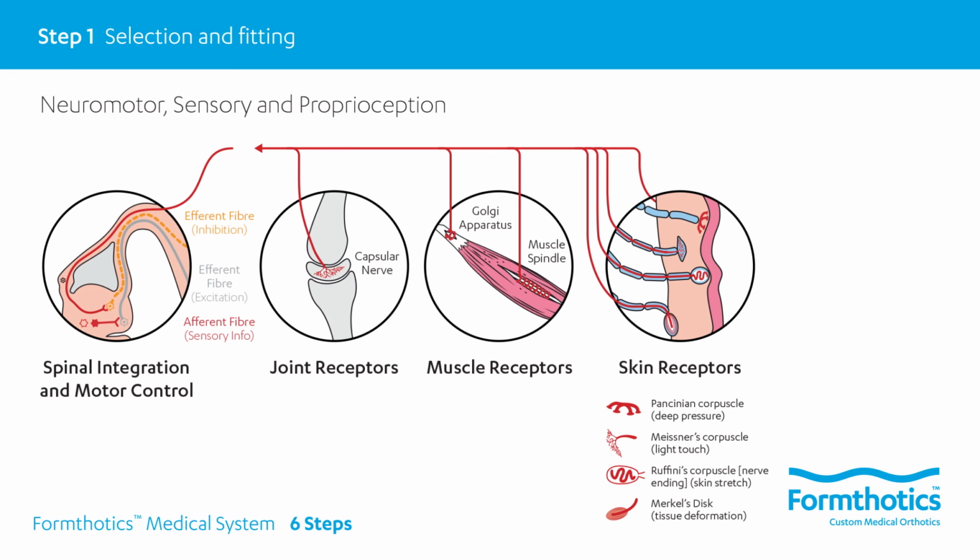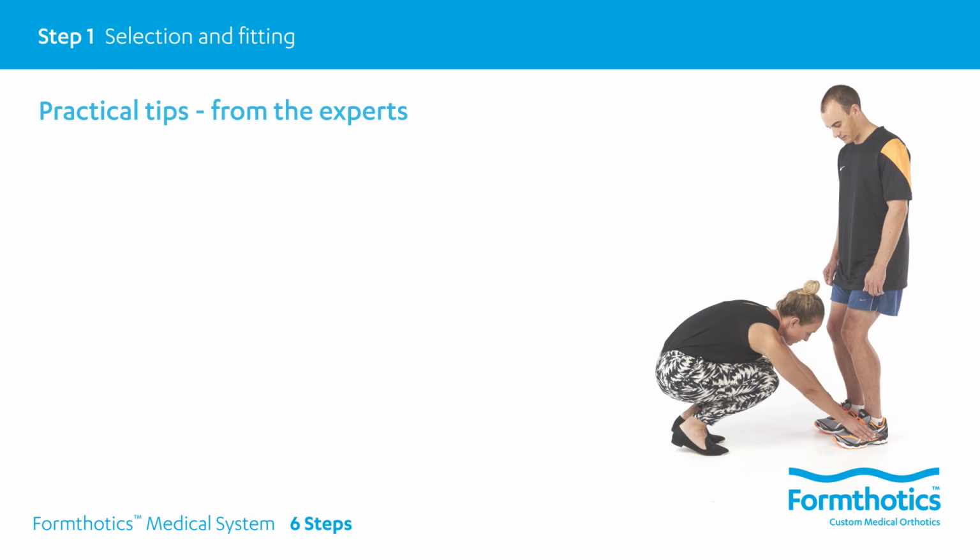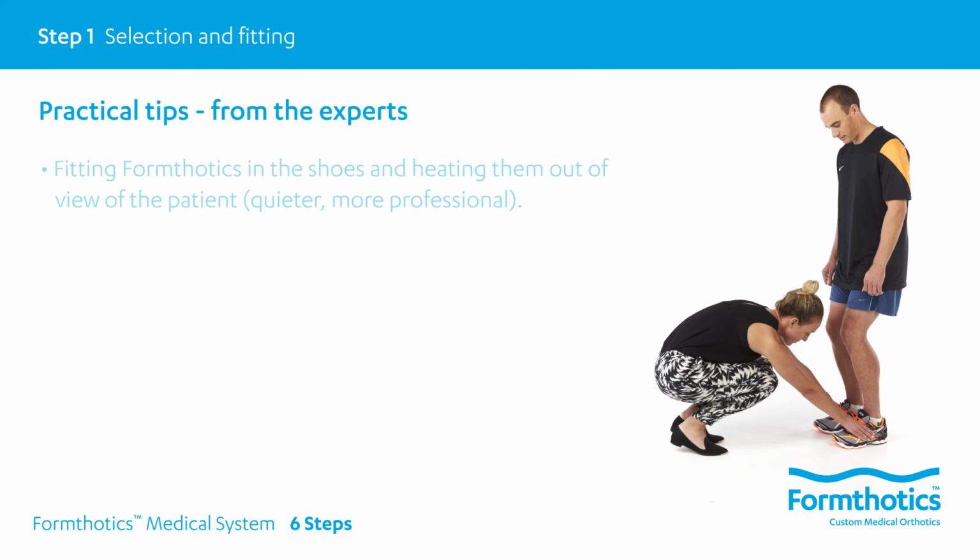Research by Murley 2010 indicates that Formthotics have significant positive effects on balance, stability, and the EMG activity of various muscles. Experienced practitioners have offered some practical tips to assist a successful selection and fitting of Formthotics. These ideas include fitting Formthotics in the shoes and heating them out of view of the patient. This is quieter and more professional.